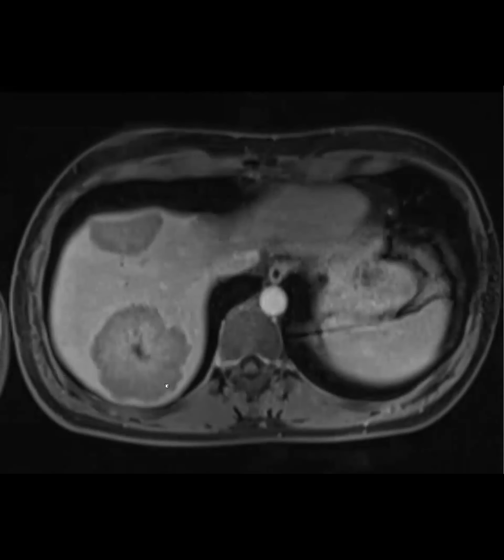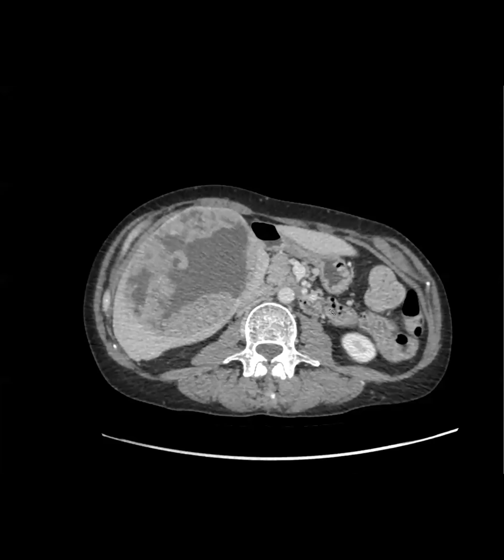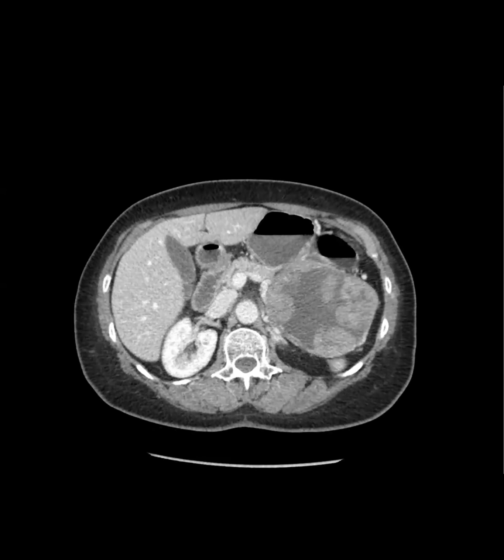So any comments about acinar? I think the take home actually would be that generally, especially if you look in the literature, especially when they're larger, they look more like this kind of lesion. The case of acinar that I've seen, it didn't look encapsulated. It was more infiltrative. Yeah, I think what I'm realizing is it can be a range.